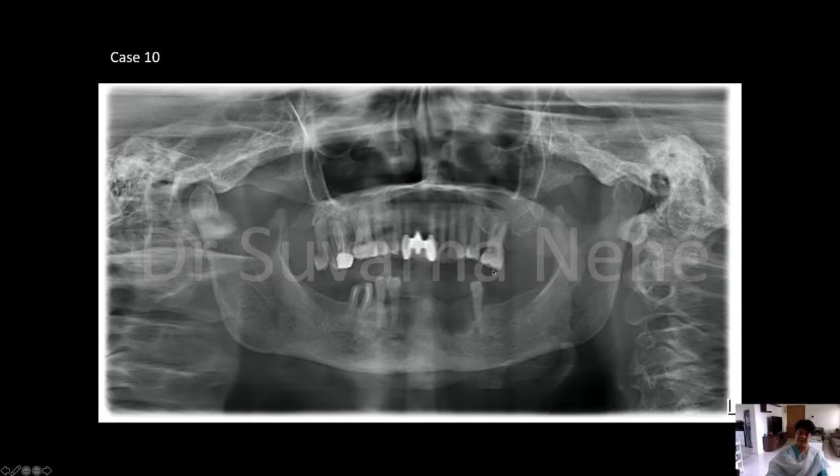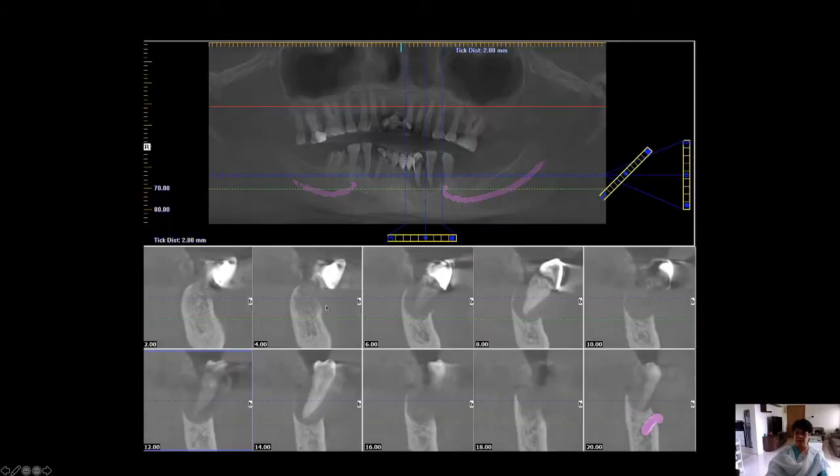Now this lady, everything is broken. Her maxillary teeth, mandibular teeth, periodontal bone, a lot of bone loss. Look at that. There is nothing there. And again, all of us come across difficult patients. She would not stay without teeth. She wants teeth immediately. I have no chance of loading implants immediately.